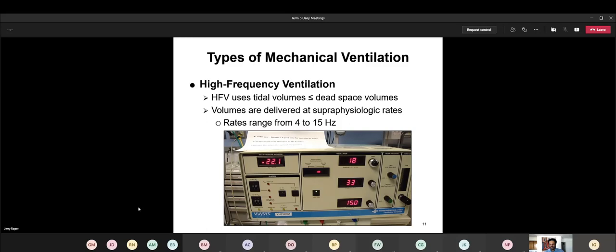Here is center, that's the center position. This is the piston's position. So you can see at any given time what the piston is doing. As long as it starts in center, it'll literally just go back and forth at a rate of either 240 cycles per minute or 900 cycles per minute based on your hertz setting.